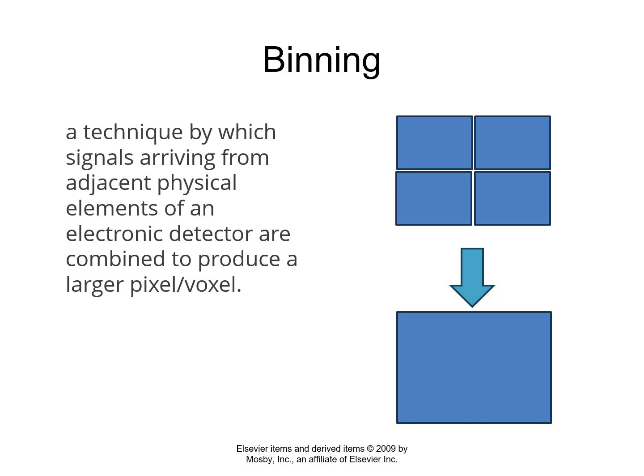It takes a little bit, and the readout electronics have to be configured a little bit differently, and you have to have the right software code to execute the binning. But it actually streamlines the readout and makes it go even faster because you're reading out fewer pixels. Now, what happens with this? Well, the pixel size is growing. So we're losing spatial resolution, but it's motion picture.